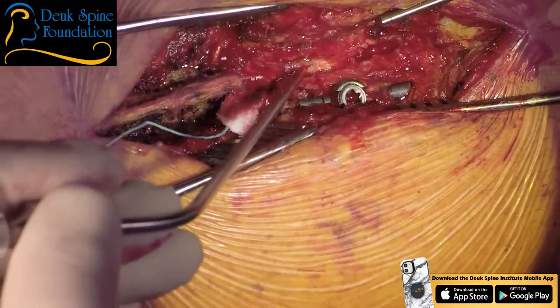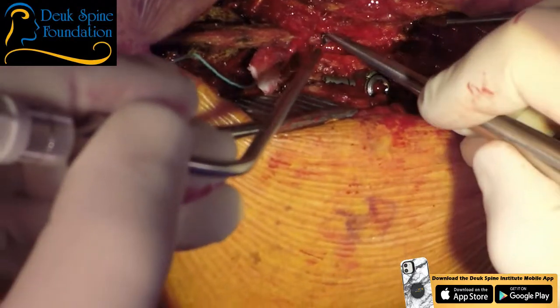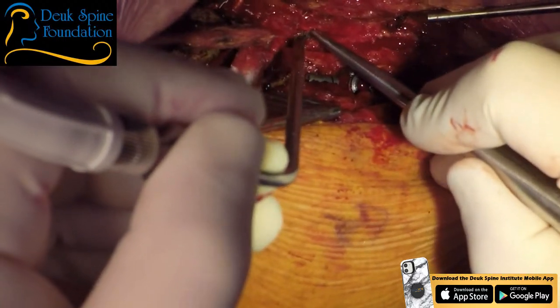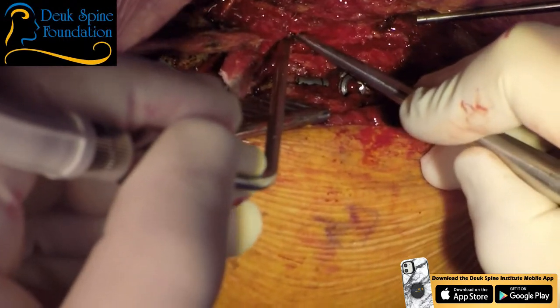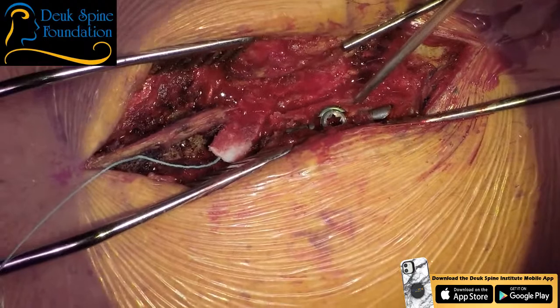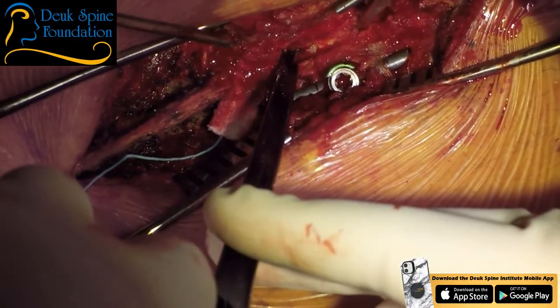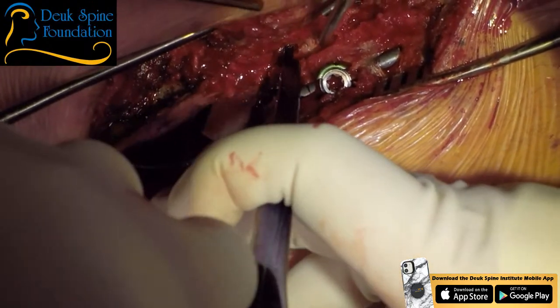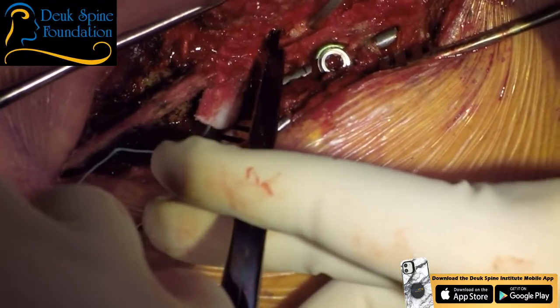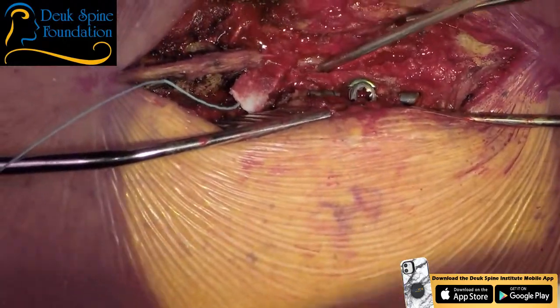Here. Let me have an angled curette. This is the last area we have to fix and then we're done. So I just need to try to free up the dura without creating any problems. Let me have a Kerrison, take. Be real careful, that little island, I'm gonna take it out. Right here. Can't see. Man, that is an abnormal facet. All right, let me have a sucker.